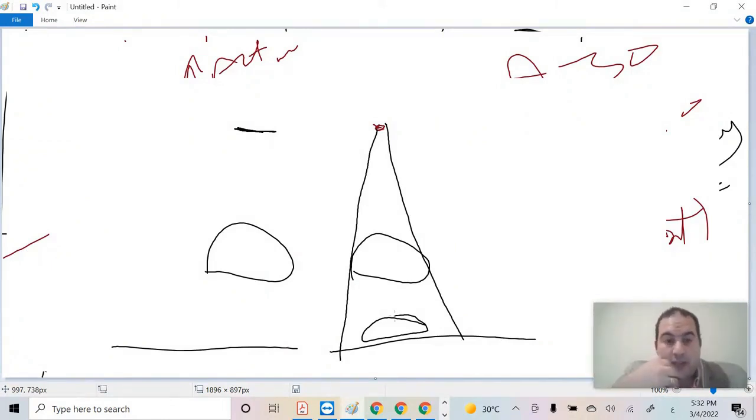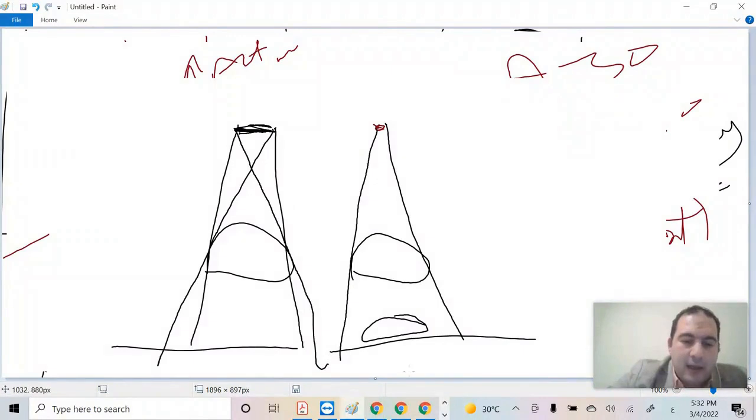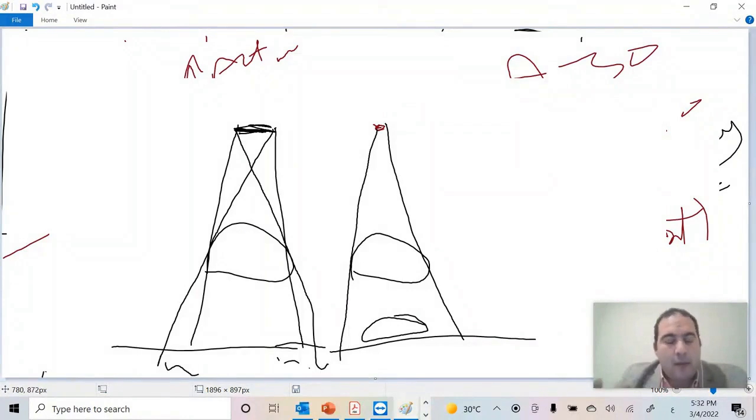In the case that your source has a certain dimension, or has a line, or has an area, you may have a beam coming from this area, hitting this edge. It is very common for a beam to come from this edge and drop down here in this manner, creating an area called the penumbra. The penumbra area causes unsharpness or a blurring effect, making the edge of your object not clear. Therefore, when I increased the focal spot, it created a problem.